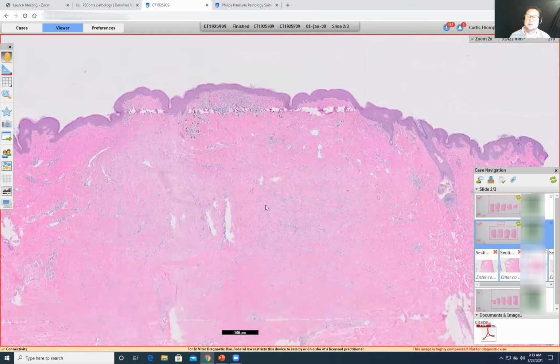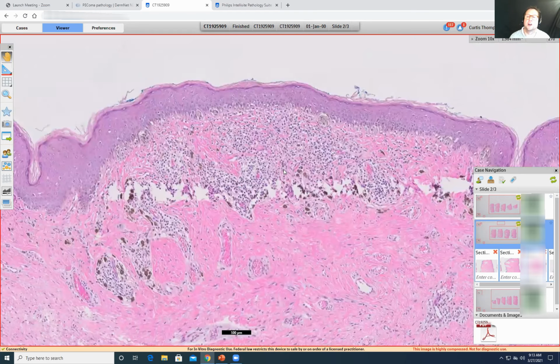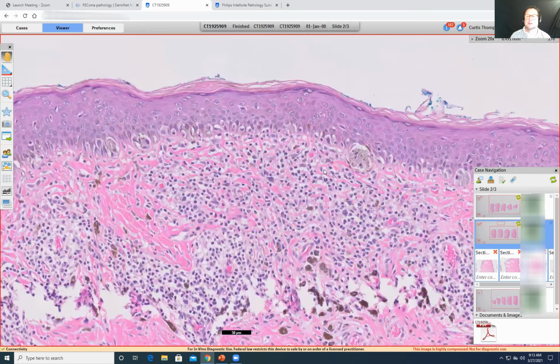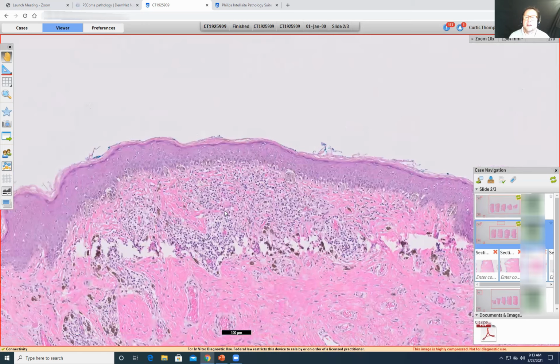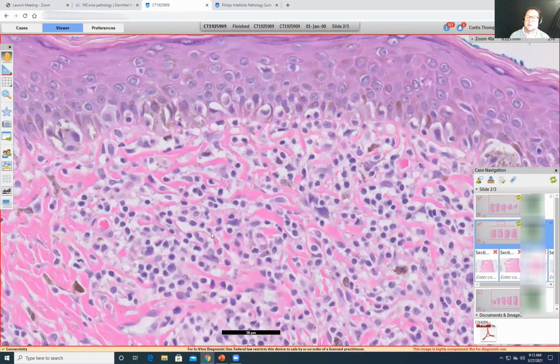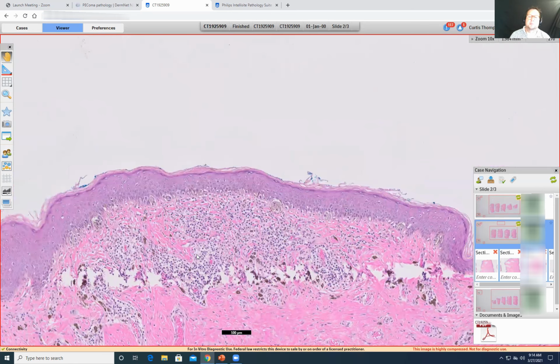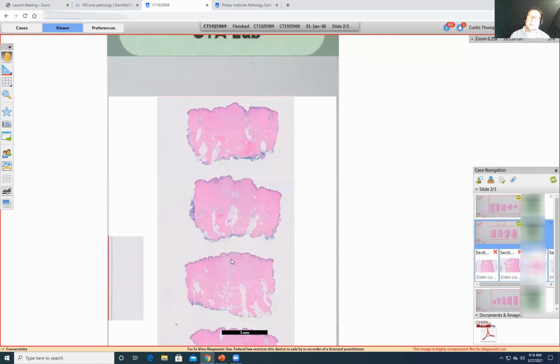So you can see here the scar from the prior biopsy, even some keloidal collagen in the scar. And then you start to see something here, pigmented, lots of macrophages right here. And at the junction, oh my goodness, confluent, single, enlarged melanocytes, even maybe a little bit of upward scatter, looks a little rubbed, and then inflamed lymphocytes in there, and some macrophages. So the point is, this could go in a book as an example of melanoma in situ, but it isn't melanoma in situ. No, this is a young person, partially sampled nevus, and it's a recurrent nevus. So it wasn't even called atypical.